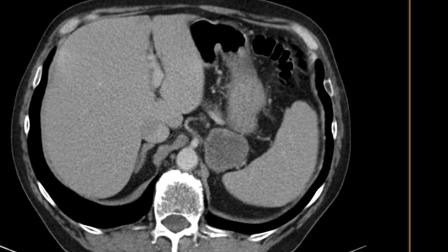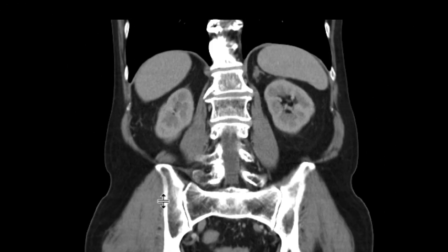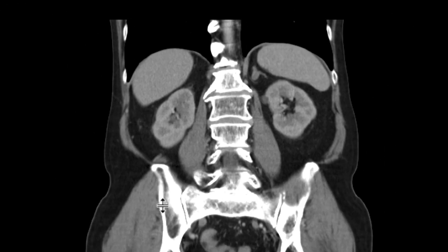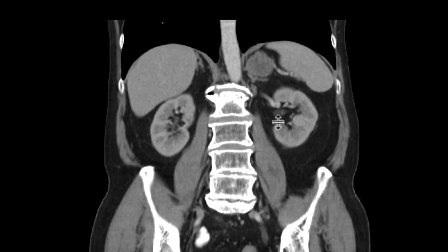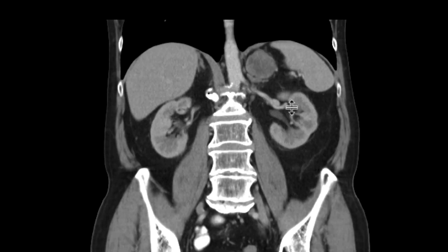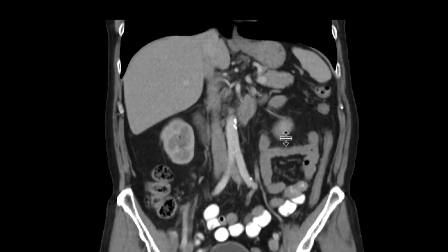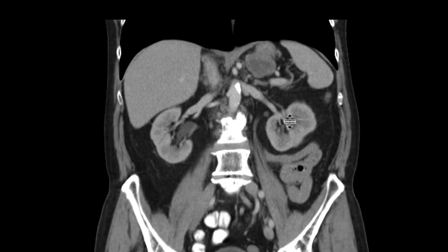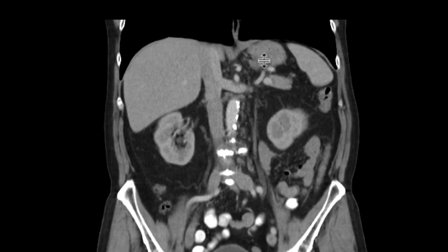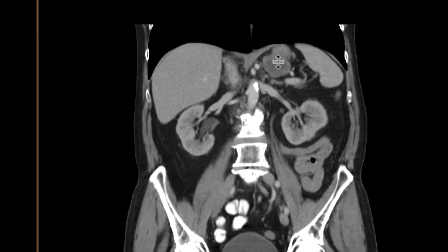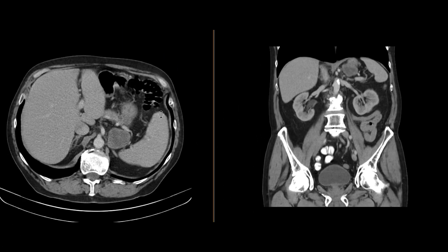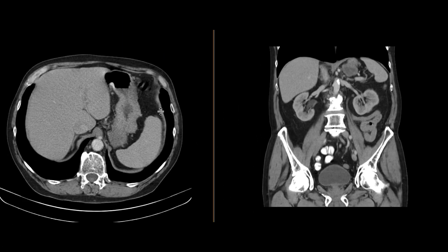Looking at the reformatted images, we can actually see that while the mass is close to the adrenal gland, there is a very thin but discrete fat plane between the adrenal gland and this lesion, such that this really is a mass that's separate from it. On the other hand, there is no real fat plane between this mass and the stomach, and you can almost see in this image that it looks like it's really arising from the stomach exophytically.